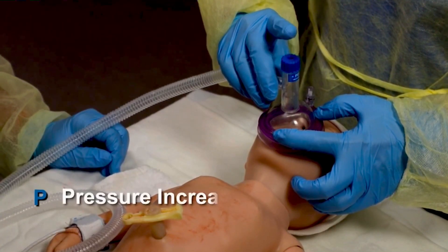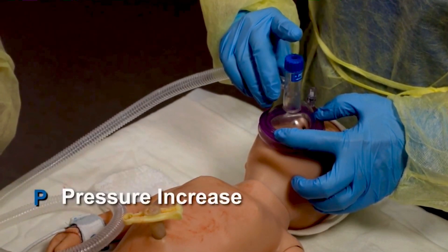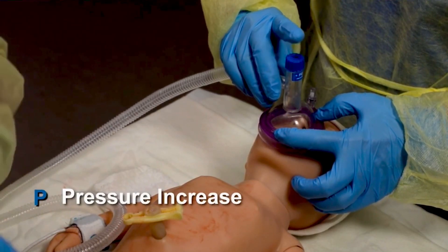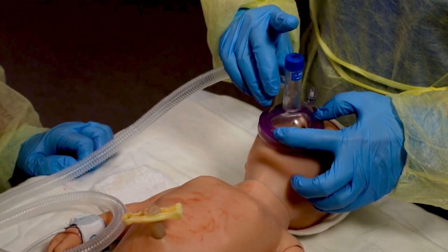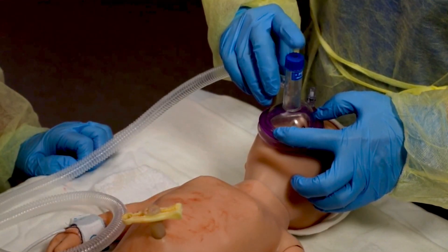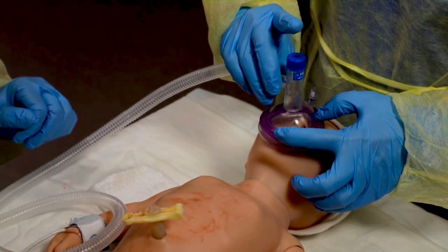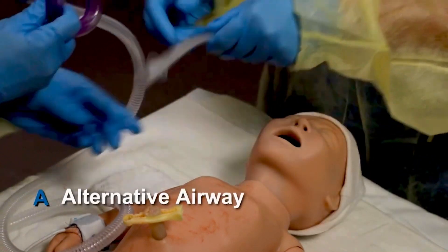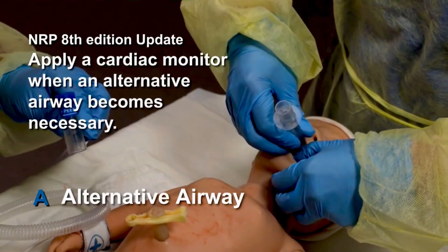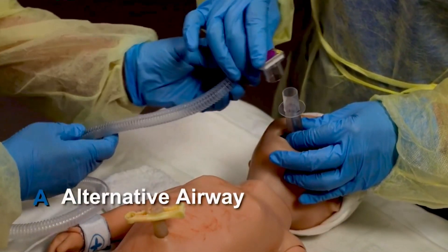If the chest still does not move, do step P: increase the pressure in increments of 5 to 10 centimeters water until you reach the maximum recommended pressure for a term newborn, which is 40 centimeters water. Attempt PPV again and assess for chest movement. If the chest still does not move, insert an alternative airway using an endotracheal tube or laryngeal mask. Ensure proper positioning of the airway and attempt PPV again.